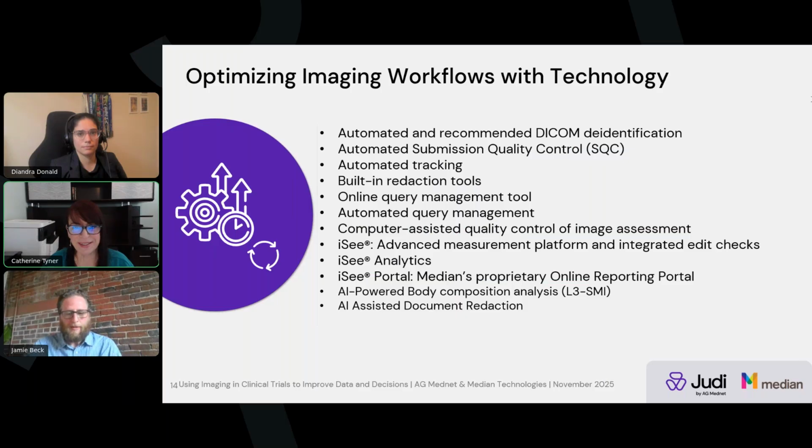So early reconciliation, ongoing reconciliation, and proactive prompting of sites for any missing images is absolutely essential to staying on track for acquiring all the images, on top of all of the best practice we've talked about making sure that when they are acquired, those images will be analyzable.